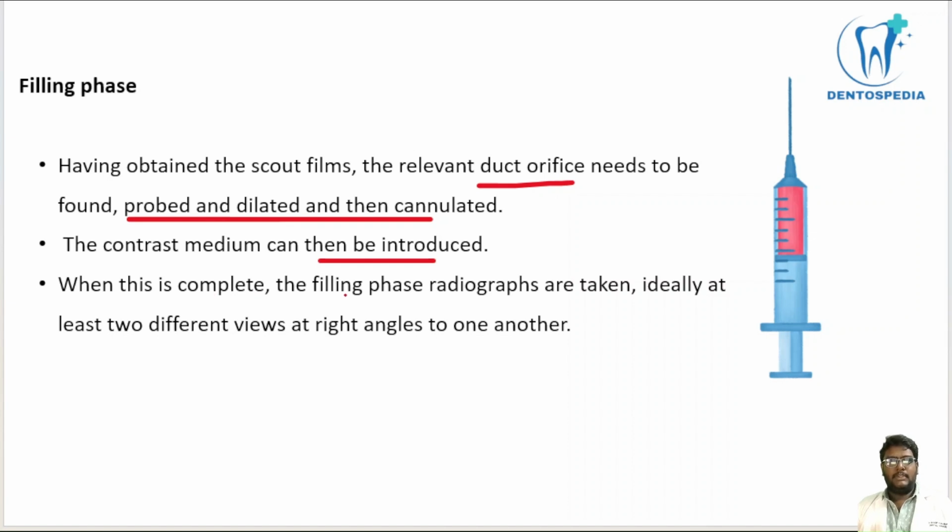So with this, the filling phase has been taken, and then we take radiographs, at least two different angles, right angle to each other. So this is about the filling phase. In this phase, we have injected the contrast medium, and then we take the X-rays after injection.